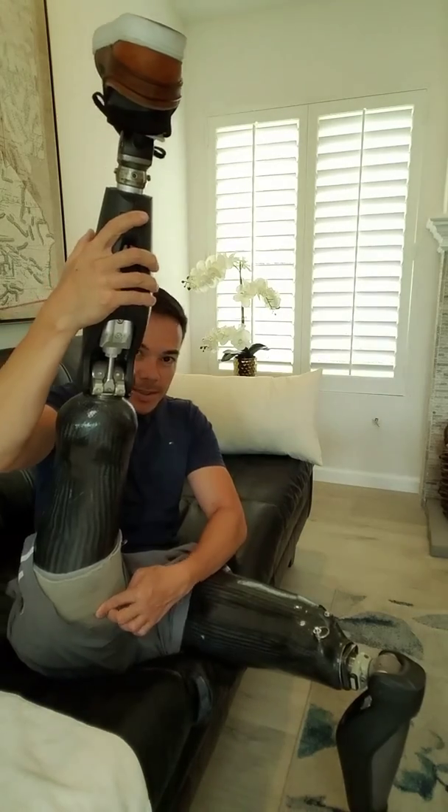And then on my right side, which I wear a single-wall vacuum system — I'll tell you in a moment why — the trim lines are even lower. The top of the socket comes right here. You can hear the C-Leg 4 beeping, and that means it's trying to communicate with Bluetooth, but that's a different topic.